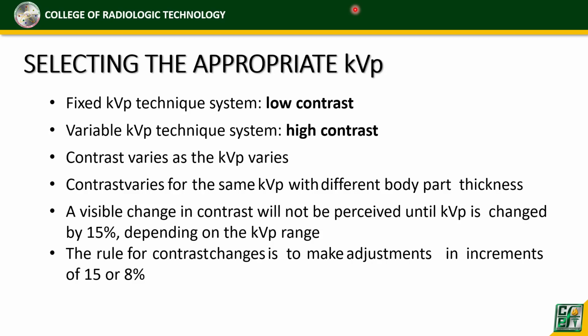Light photons na siya, di ba? Tama ba? Light photons nga ba? Exposure ng the eyes. Yes, very good. Okay. Buti naalala nyo pa. So yun. The only way na malalaman natin is kapag nag-develop tayo, walang image na lumabas.